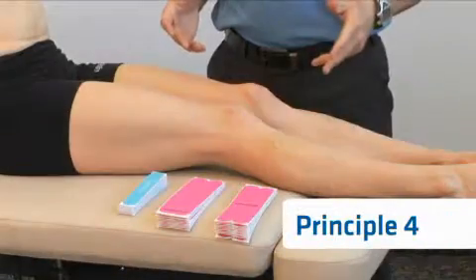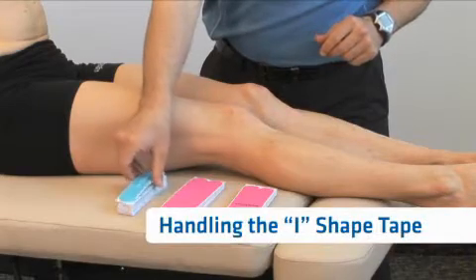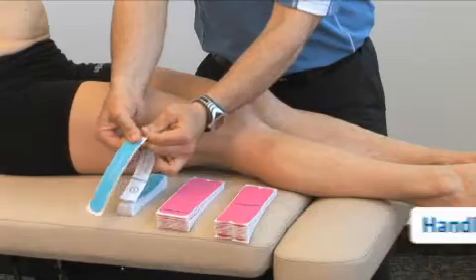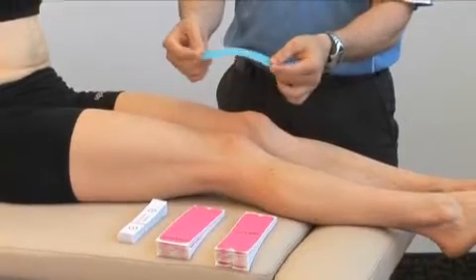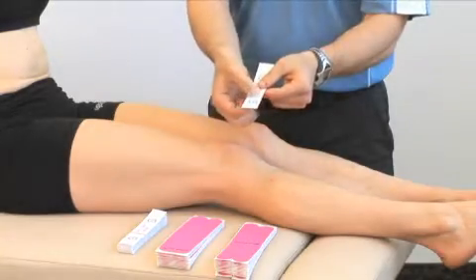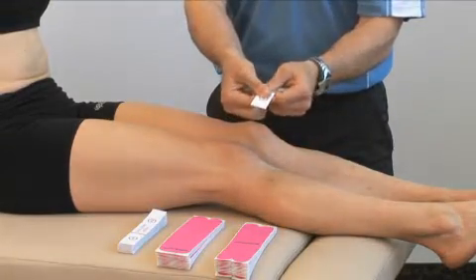Principle number four: handling the tape. Select the pre-cut that you'd like to use, tear it away, separating it from the other ones. Then when handling the tape, turn it over. Along the black lines there are perforations — you want to tear the perforations before beginning the application.